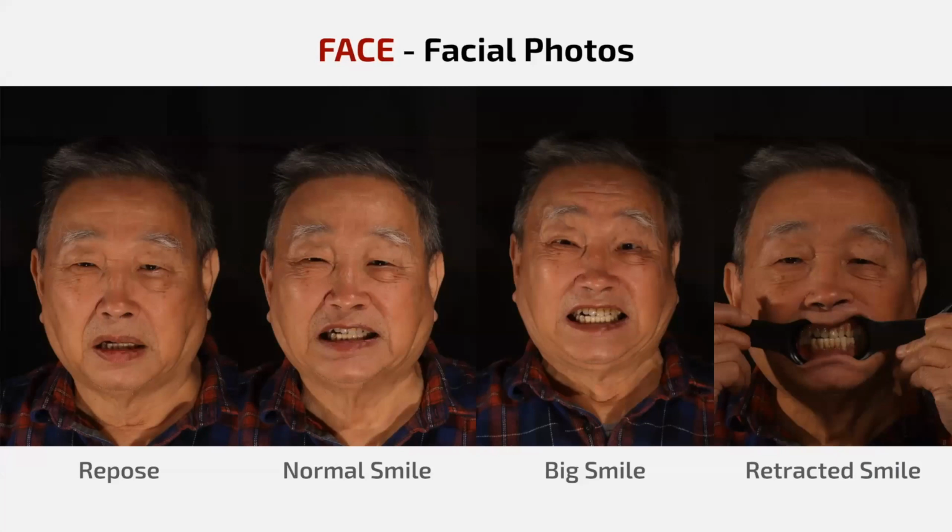For the face, these 4 photos really are the minimum that a lab will require to make sure that they actually give you a proper design of the prosthesis. So the first, of course, is repose.